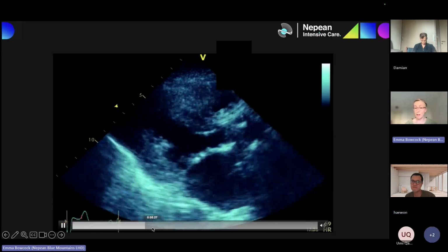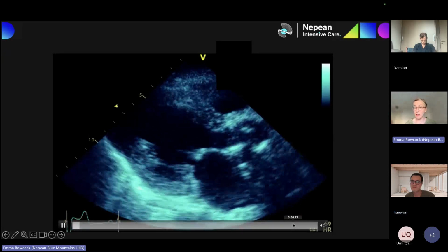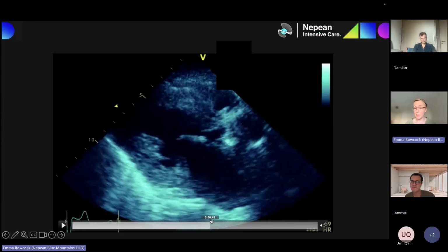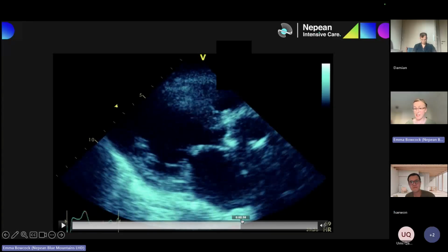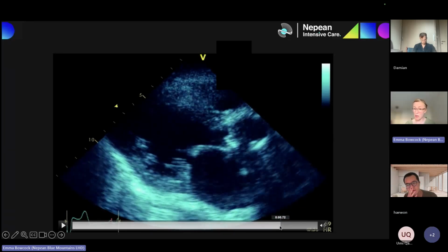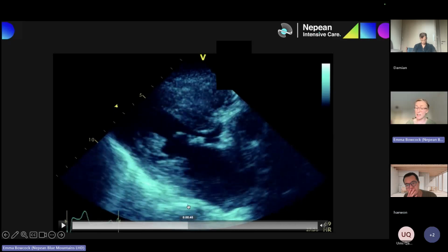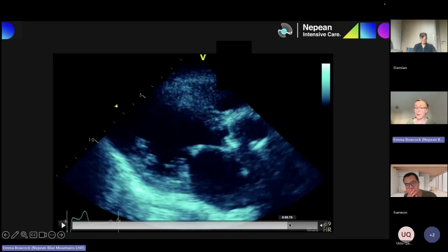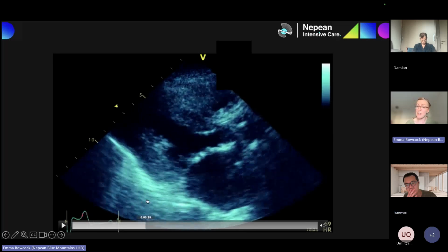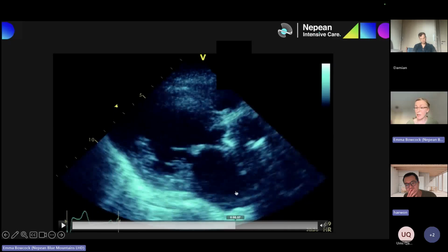The striking abnormality in this view, especially with this story, is that the aortic valve looks highly abnormal. I can see opacities that could be the cusps of the aortic valve potentially protruding into the LVOT. There could be some side lobe artifact from the thickening with the bioprosthesis. However, given the story, I definitely want to interrogate that in more views.